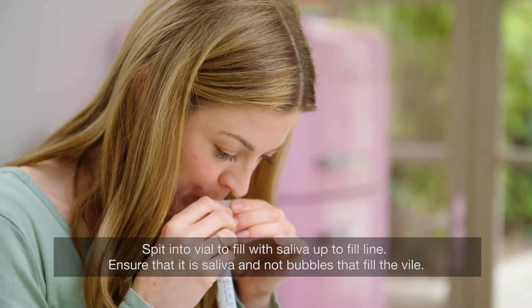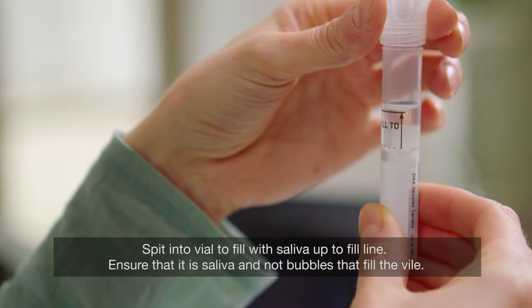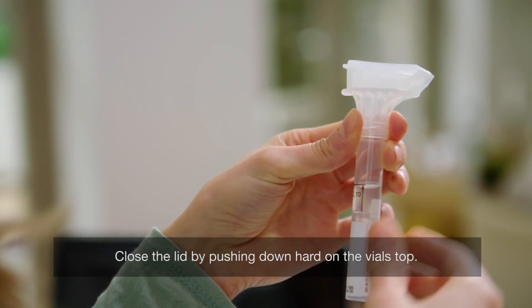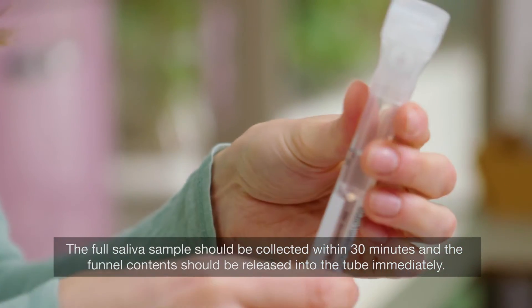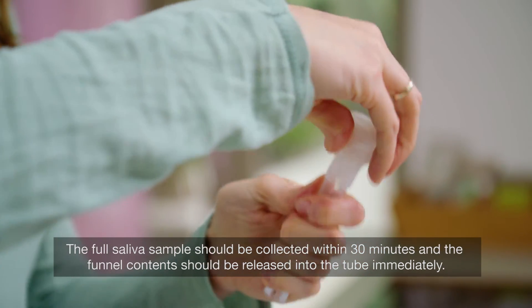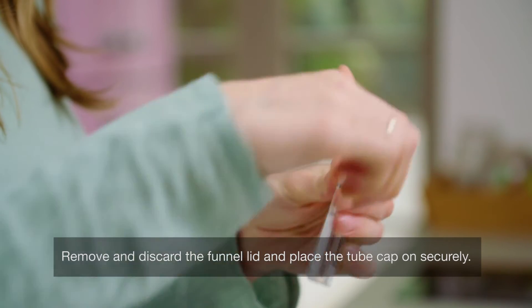Spit into the vial to fill with saliva up to the fill line. Ensure that it is saliva and not bubbles that fill the vial. Close the lid by pushing down hard on the vial's top. This will release a stabilisation buffer into your sample. The full saliva sample should be collected within 30 minutes and the funnel contents should be released into the tube immediately. Remove and discard the funnel lid and place the tube cap on securely.